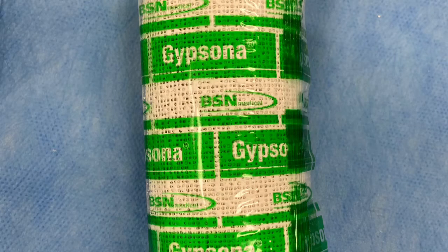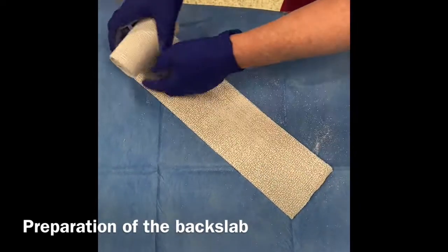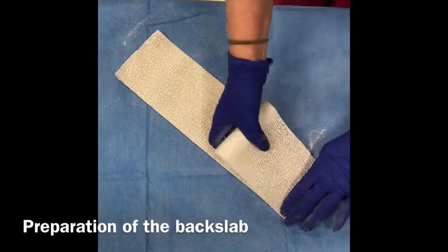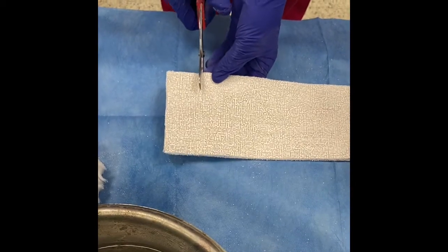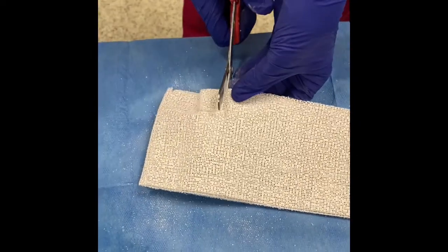Application of a back slab. As previously mentioned, usually we use plaster of Paris to achieve this. Typically plaster of Paris comes in rolls of different widths. Once the correct width has been selected, a back slab needs to be created. The limb is measured and the appropriate length is rolled out on a flat surface. Typically five or six lengths are laid out to create the back slab and the excess is cut away. If a forearm back slab is being made, a small segment is cut away for the base of the thumb to fit in on the final product.